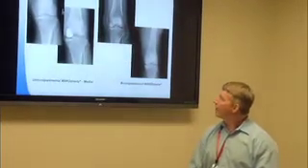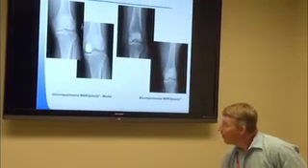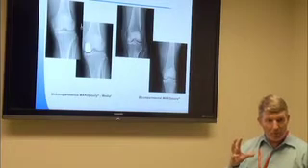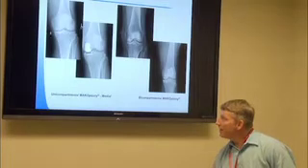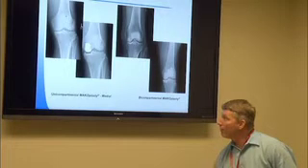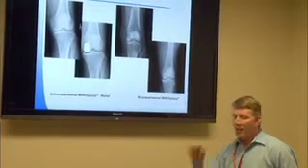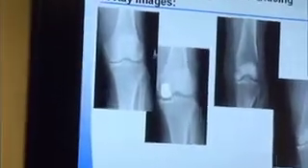So here are some X-rays, and I'll point them out to you. This knee here, they were complaining mainly of pain on the inner part of the knee. That was their isolated complaint. I looked at these X-rays, and basically you can see here, I'm going to point out to you guys, can you see the space between this, the thigh bone, and the leg bone? The space between these bones is our knee joint. The space should be fairly uniform, and it should be fairly smooth. The edges of these bones should be fairly smooth. When the space starts to narrow or the bones become irregular, that's a sign to me that there's arthritis in that part of the joint.